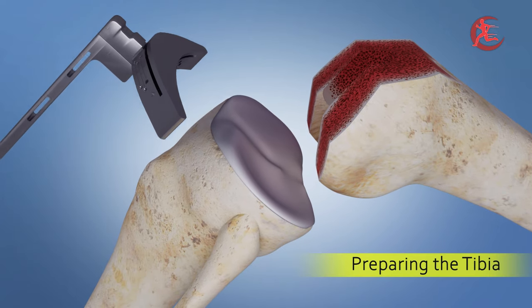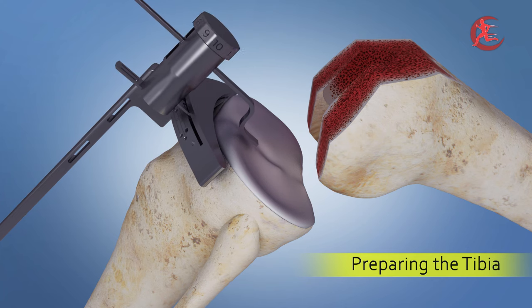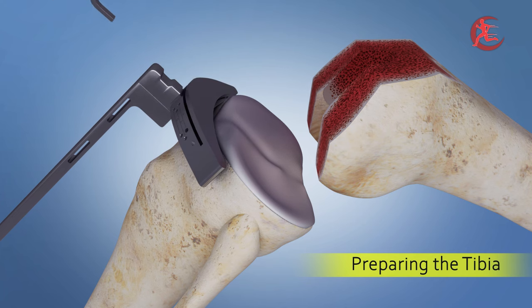Guided by precision, the surgeon meticulously prepares the tibia using similar guides, ensuring optimal size and alignment for the implant.